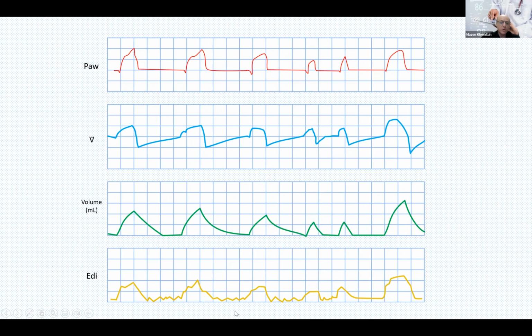Look at this more even electrical activity of the diaphragm, giving you a more even rise in the pressure. Here, minimal activity caused less pressure support for the patient. Higher activity here caused higher support. Take a look at this one. Very high activity generated high pressure. You can see the pressure that is given to the patient.